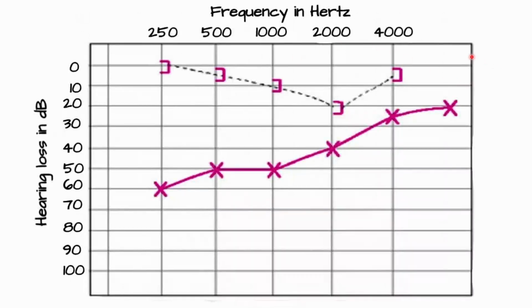Okay, this is another graph. Again, if we see, the air conduction graph is below 20. Now it is crossed, so this is of the left side. So the air conduction graph is below 20 while the bone conduction graph is above 20. And if we see the minimum gap on the two closed portions of the graph, it is again more than 15 decibel.